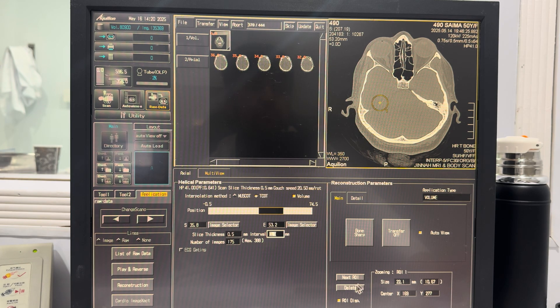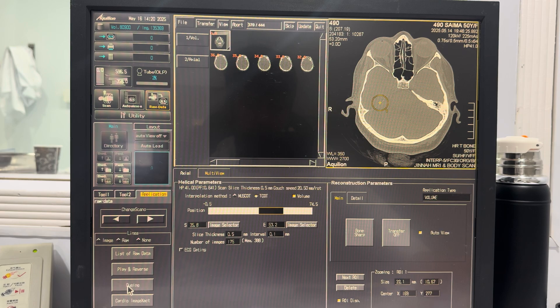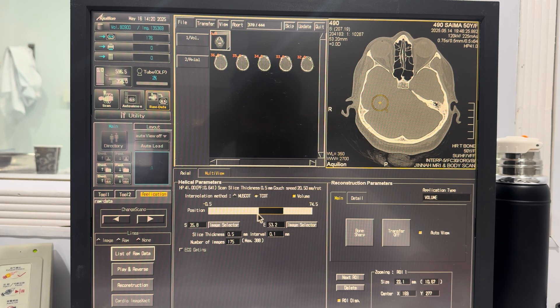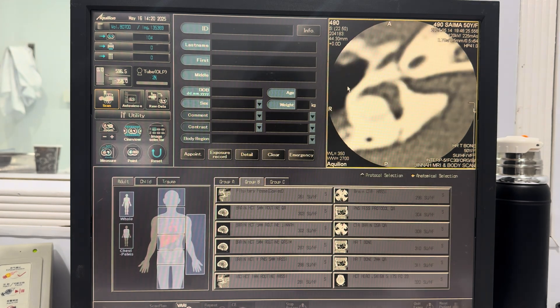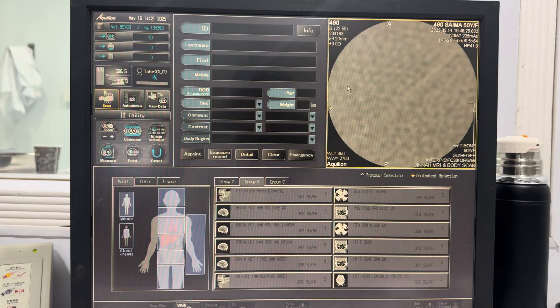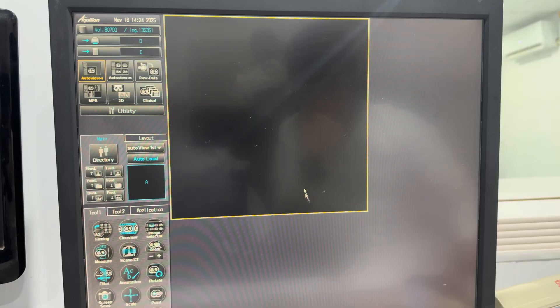Once all the parameters have been configured, click the reconstruction button to initiate the process, just as I'm doing right now. Once the image is reconstructed, navigate to the 3D console and click on the 3D button.